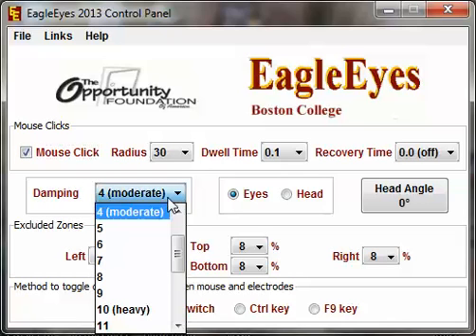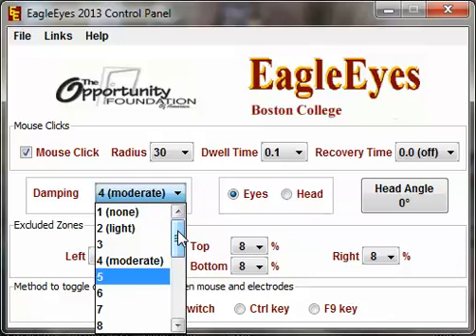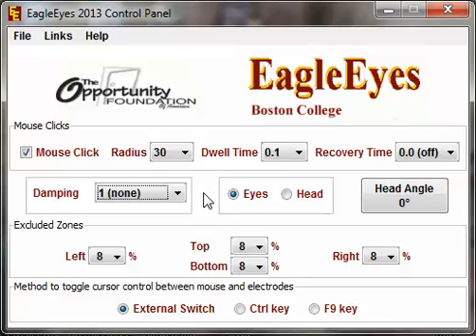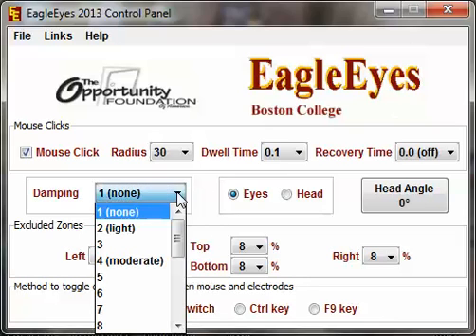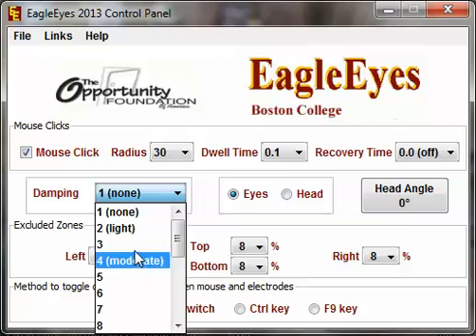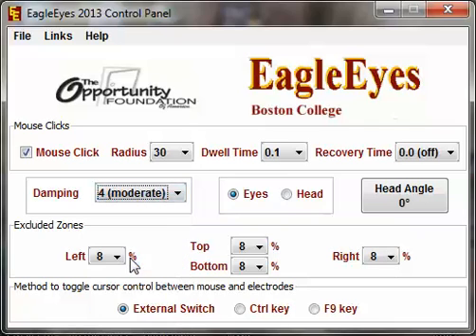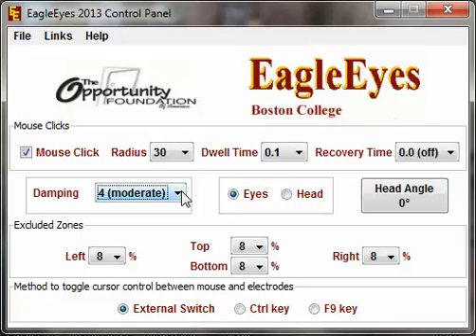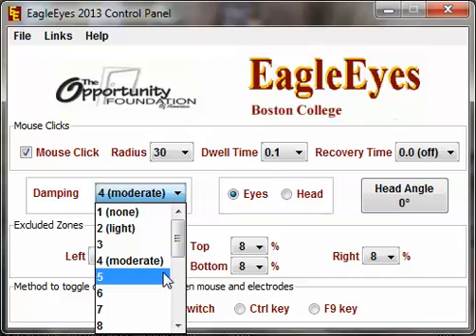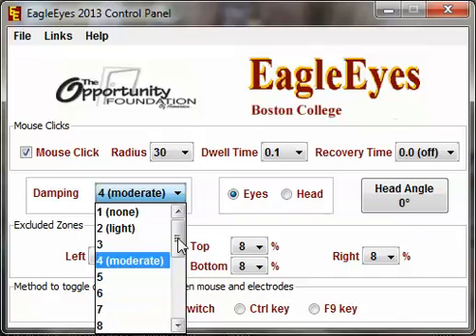The damping setting is kind of a shock absorber. Starting on a 1, you'll notice the cursor bounces and jumps quite a bit. We want to set damping usually between about 3 and 5, which smooths out the signal and keeps the cursor more stable. If you increase the gain knobs on the console — the gain being the sensitivity — you also need to increase the damping. So if you increase the sensitivity of the signal, you may need to go to a 5 or 6 depending on the user.